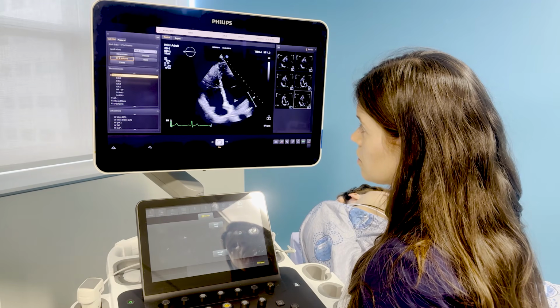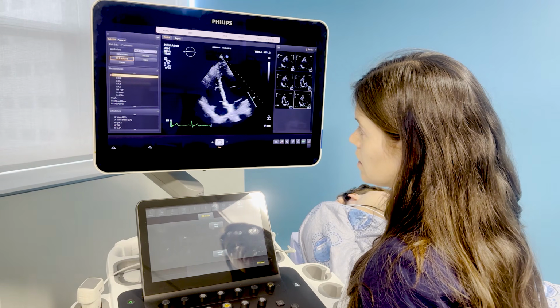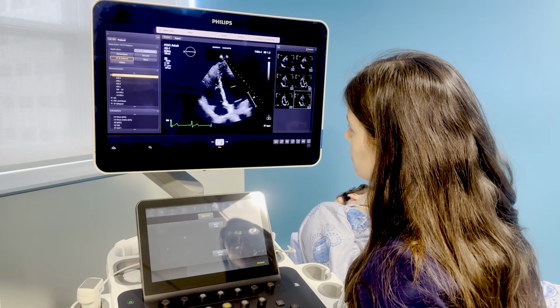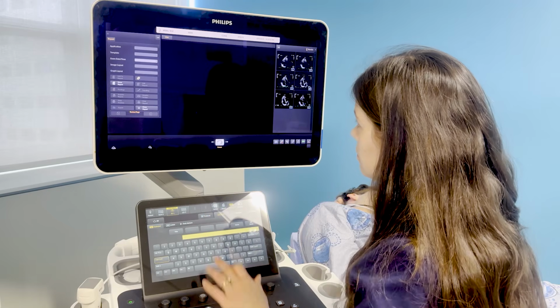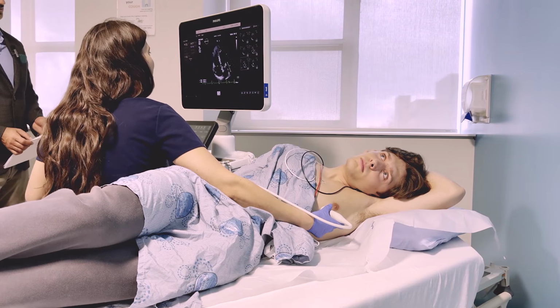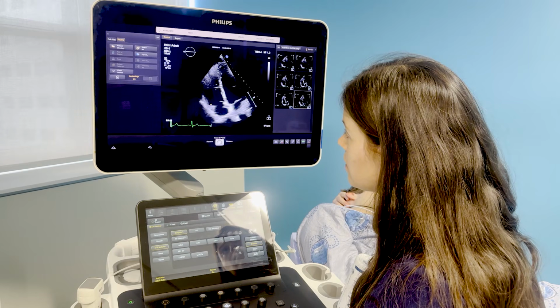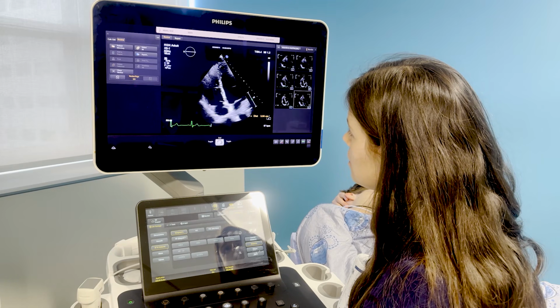So then when I go to measure the RV size, again, this will be end diastole. I usually go by valve timing. So as soon as the valve has closed, can you show us that part again? Yes. So, end diastole, the valve is closed, and then we're going to take a measurement from the blood tissue interface with the lateral annulus, and then come into the septum.